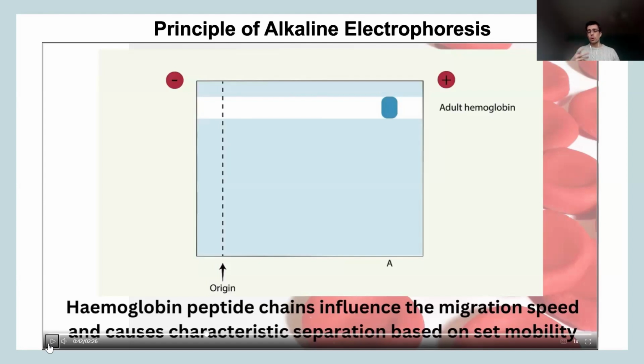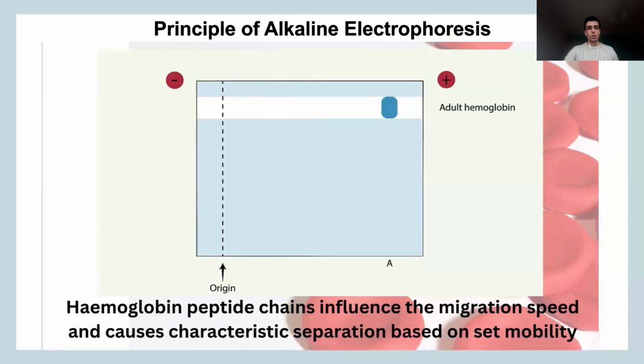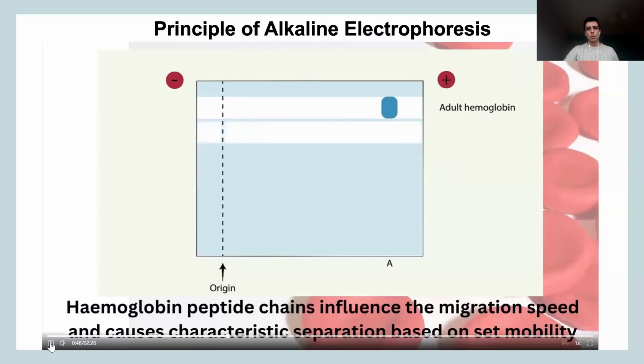So you can see that band, and I'm going to show you some results, how easy that is to interpret as well. But within the realm of hemoglobin, it's not just hemoglobin A that you have. You're also going to have hemoglobin F, or fetal.